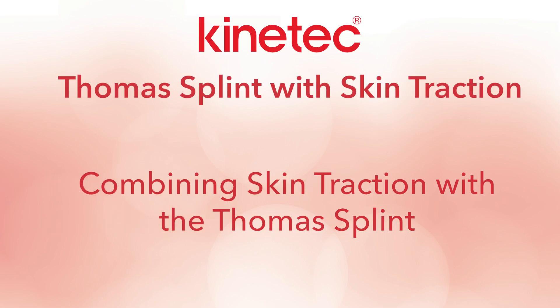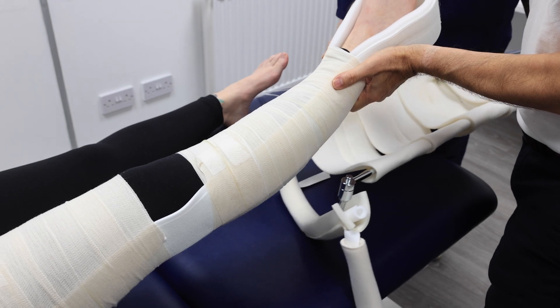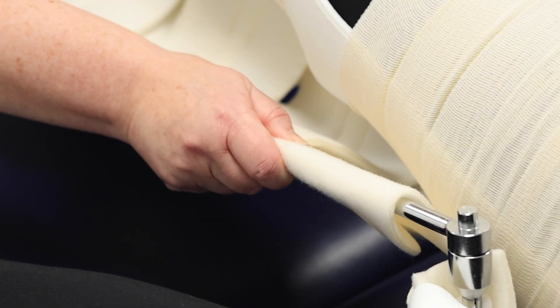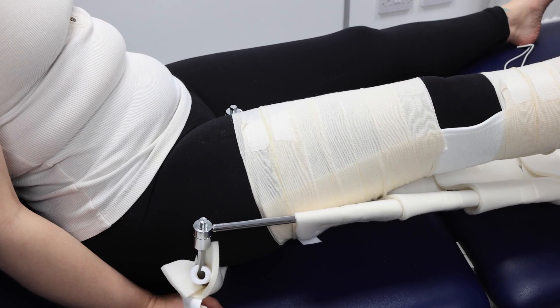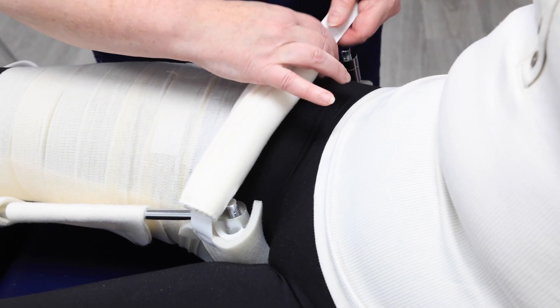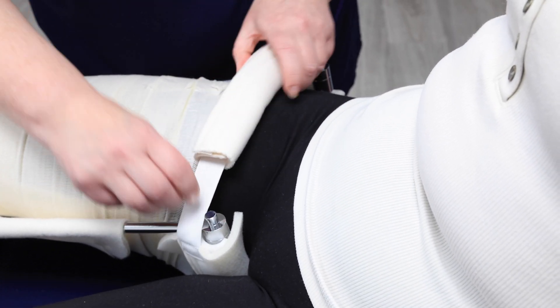Combining skin traction with the Thomas splint requires two people. As one clinician slides the splint into place, the other holds the slings to keep them from shifting. Once positioned, clip the hoop cover and slide the foam padding over the buckle to prevent pressure damage.